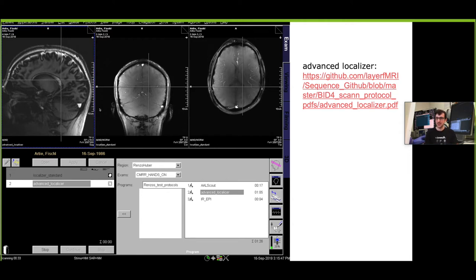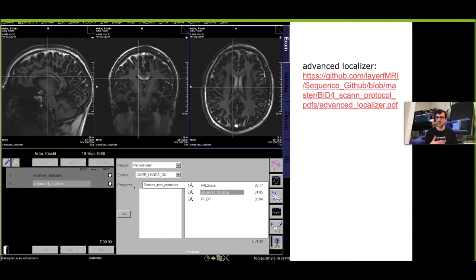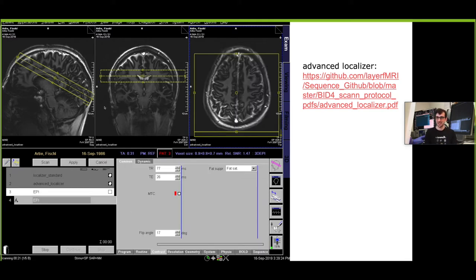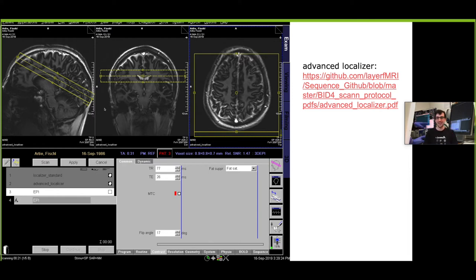Even though it takes a bit longer the images are 2D so you can just drag and drop them during that one minute it takes to acquire them. Then you already see here these structural features, for example the calcarine sulcus which would be of interest here for this example experiment, so we can place our thin slab very precisely to the area that we care about.